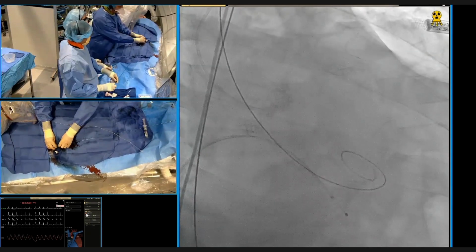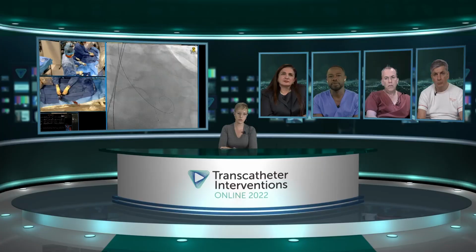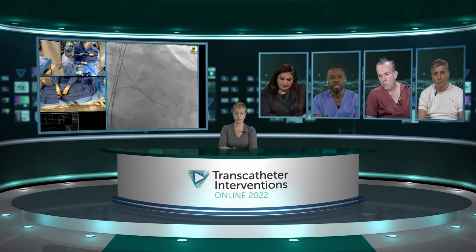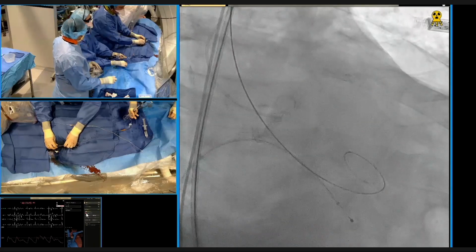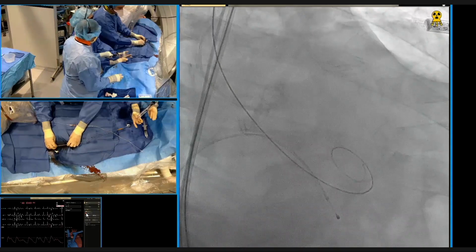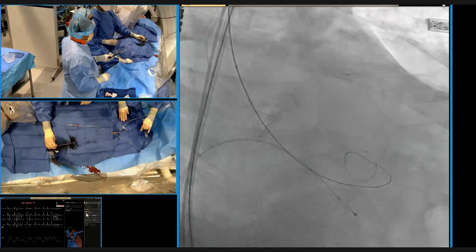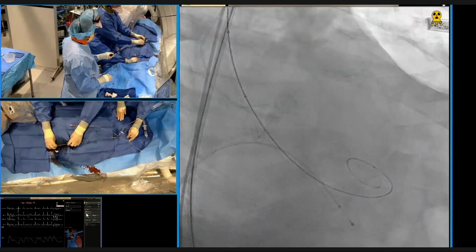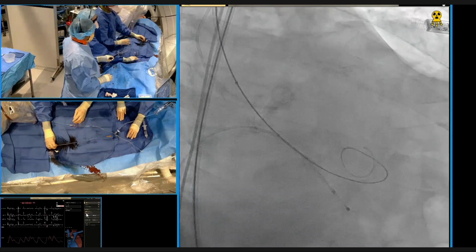So it's true that this is a borderline case in terms of sizing, with the supra-annular measurements being greater than the annular dimension. Balloon sizing may be useful, but what I would have done differently is to use the circle method. On the CT scan, you put a 26 circle within the anatomy of your patient, and you may anticipate what is going to be the overall interaction with the surrounding structures, particularly the risk of sinus sequestration.